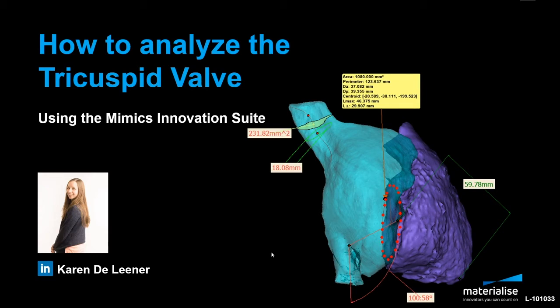Currently there is a variety of trans-catheter replacement and repair devices being developed. The Mimics Innovation Suite can be used in different phases of this development process — from R&D to get an understanding of the complex anatomy of the target population, to first screening and planning, and finally to scale up through scripting for larger clinical trials and the commercial launch. Since the tricuspid valve is a complex structure and given the variety of devices being developed, I will explain multiple key measurements.